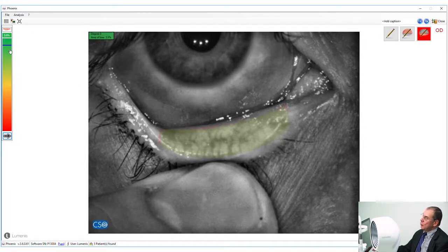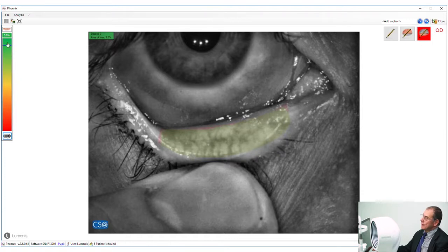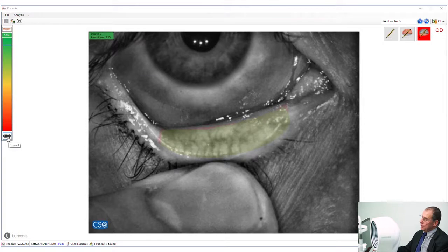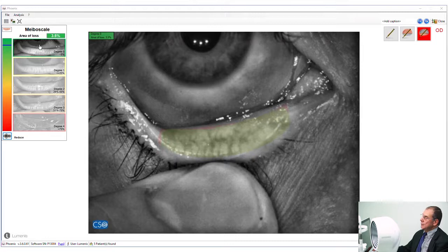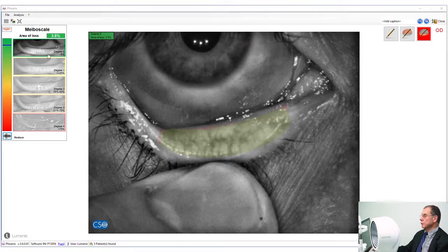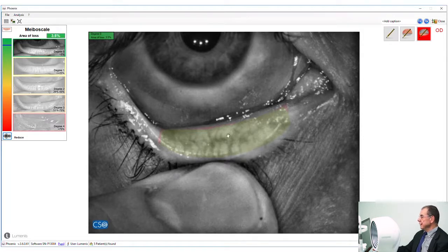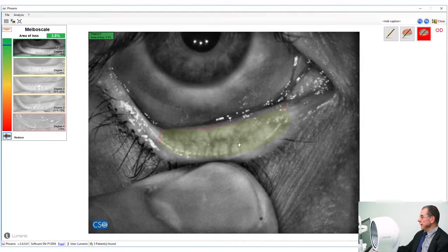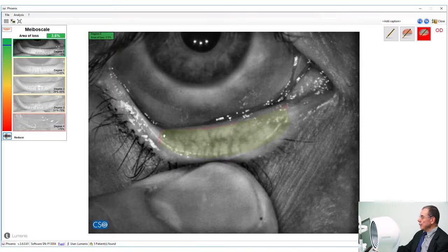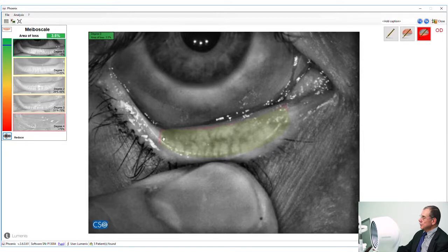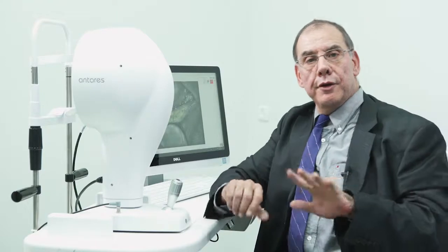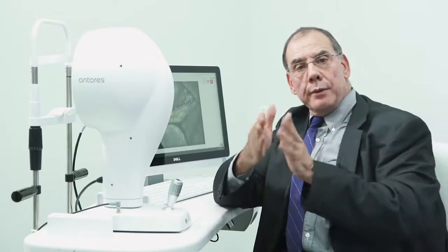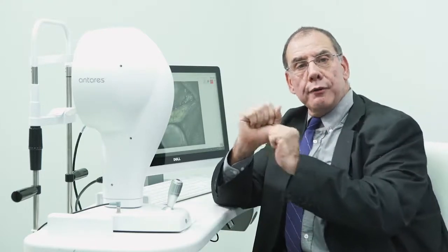This is the scale for the meibography. If we open this and expand it, it's going to show us the actual library images. The library images are very important because we should be looking at the library images and the image that we've got to see how similar they are. When we look at the meibomian glands, it should look like a piano, almost like the keys on a piano—black and white, black and white keys.